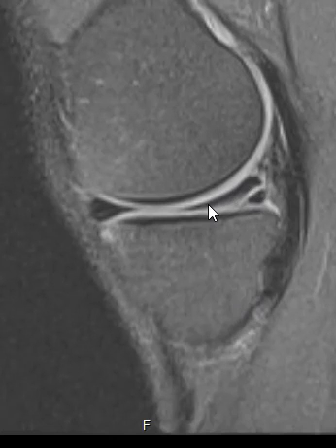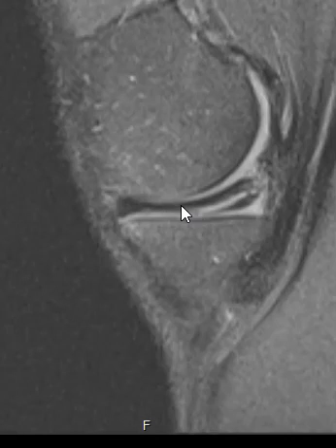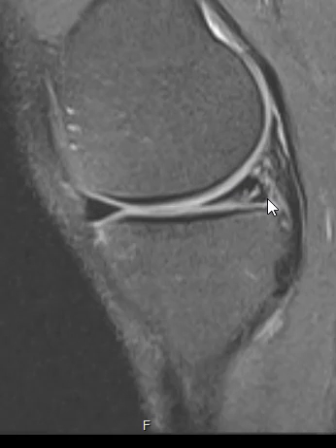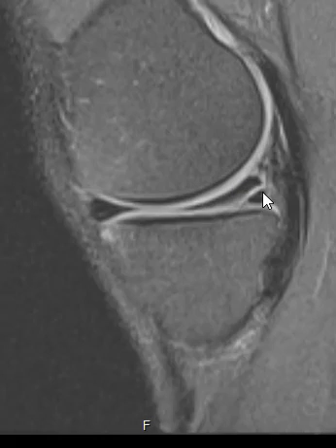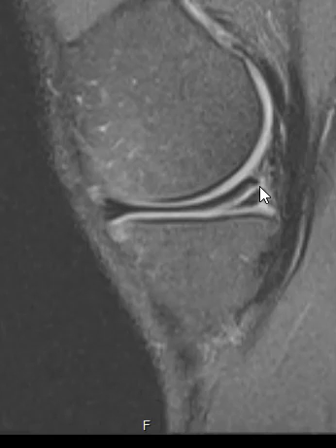Over here is the back of the medial meniscus, here's the front — this is called the anterior horn, this is called the body, this is called the posterior horn. So the posterior horn is in back, and we see this oblique undersurface tear. It contacts the back of it here — this is called the capsular surface — and it comes down to the meniscus undersurface.